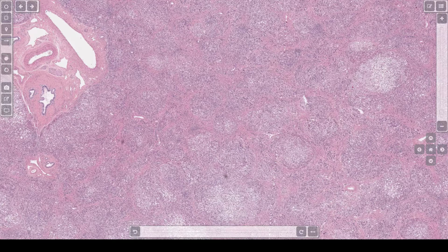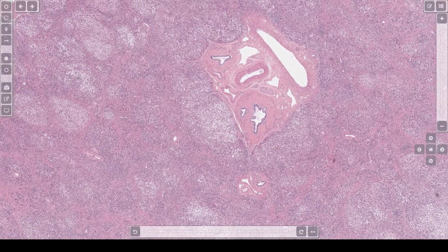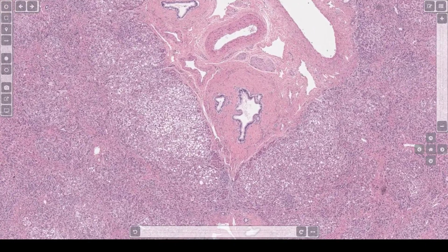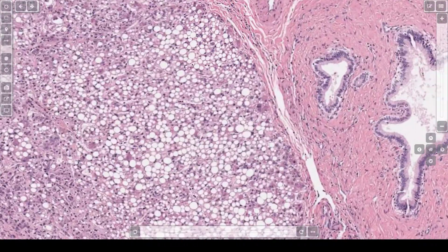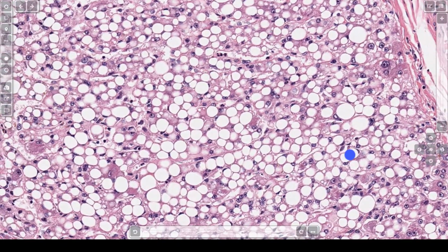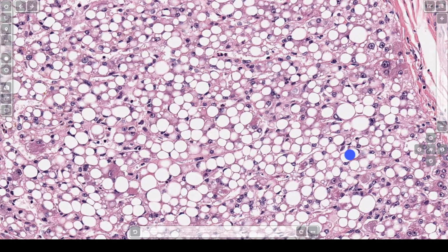In this particular case, this is, of course, cirrhosis. Let's look at the other findings of alcoholic liver disease. At this power, you can see the steatosis. Steatosis means there are fatty droplets inside the hepatocytes. This is abnormal, and these, of course, are the fatty droplets. Here's one here, here's one here, here's one here. There are, of course, quite a few.